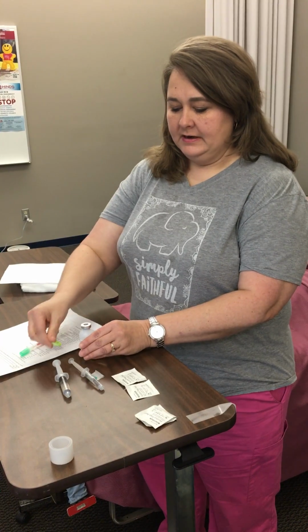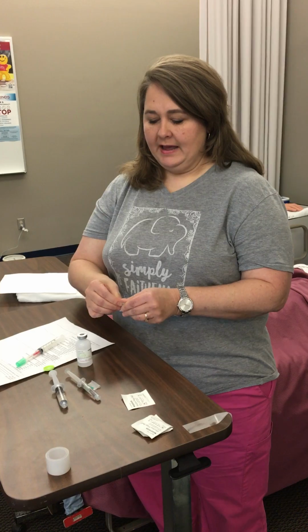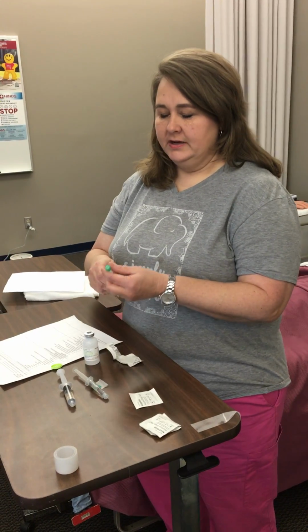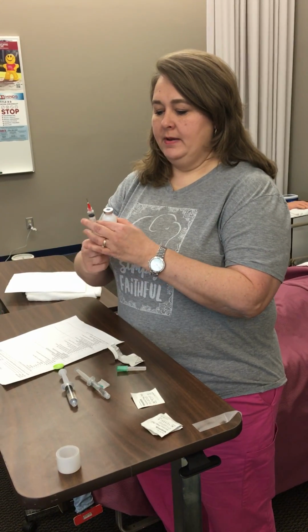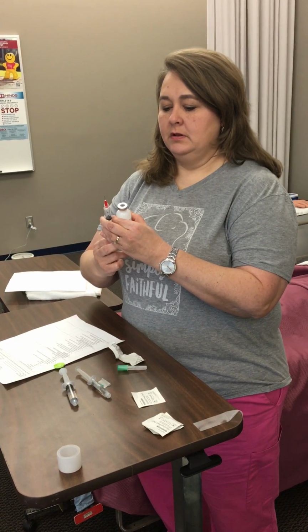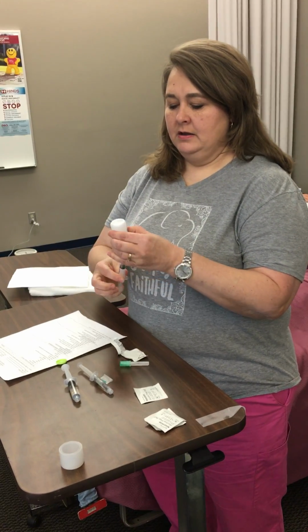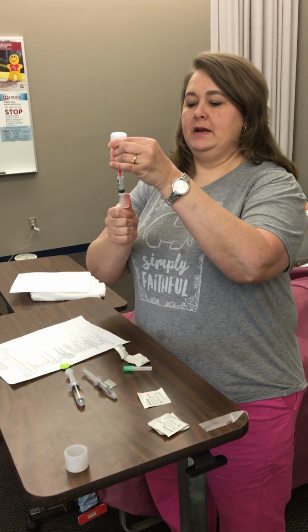I'm going to uncap my vial here. This was a brand new vial, so I don't necessarily have to swab, but if it's not new, I want to swab the top of the vial. Just like your steps in your IM and sub-Q, we're going to obtain our medication, and I need 3 milliliters of this correct medication. So I'm going to inject the air and withdraw 3 milliliters of my medication.